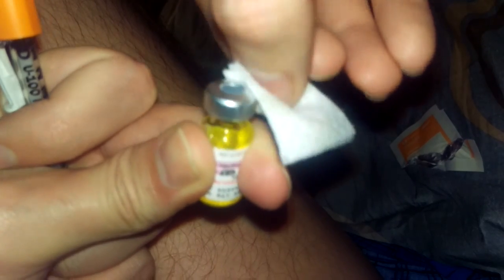So the first thing I'm going to do is open this bad boy up, get out the little alcohol swab, and then I'm going to do an area right here. See, this is just the regular side of my thigh. And you alternate — I do an injection every week. I'm not exactly sure how other people might do it, but I feel like this is probably the most common. And then I'm going to let it dry right in here, and then I'm going to clean the top off. Make sure you don't get anything inside yourself, and then let that dry and give it a shake just to make sure.